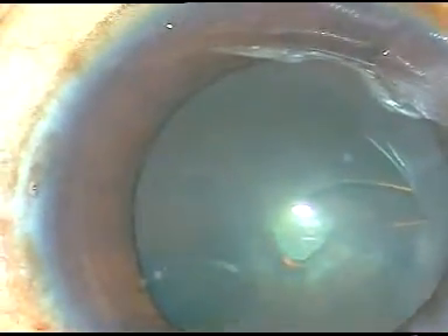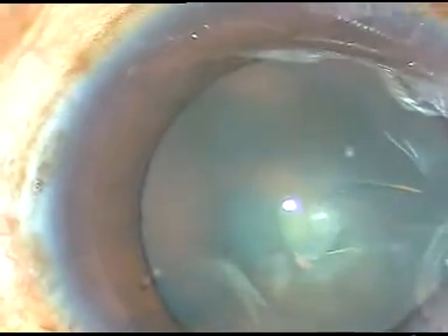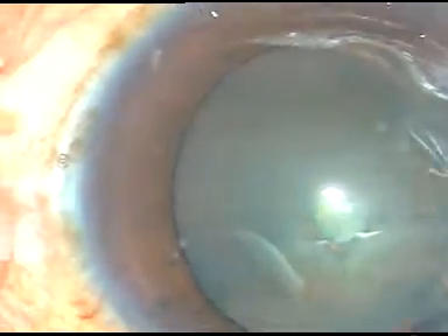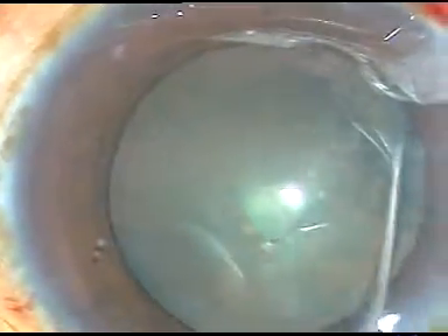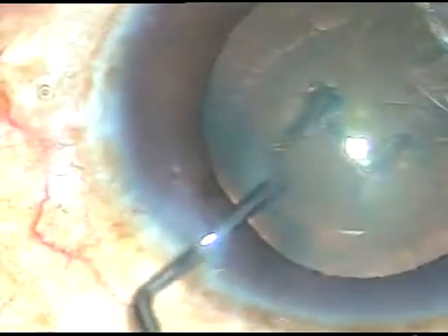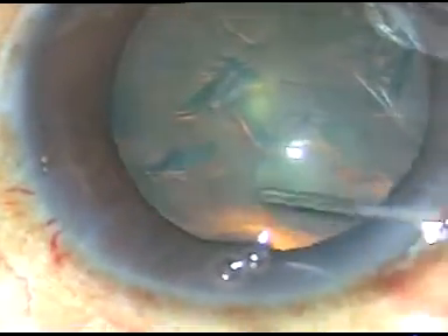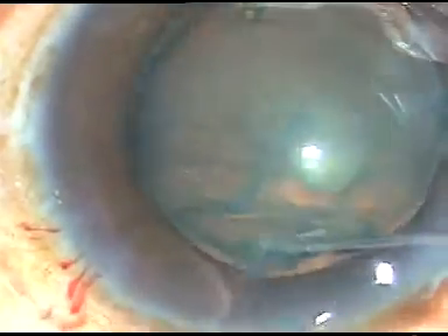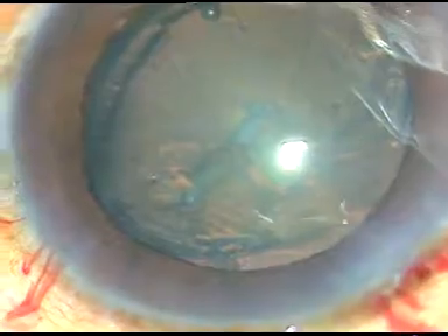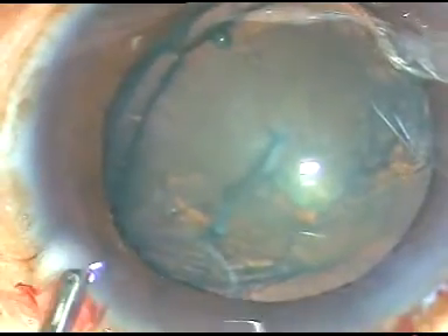Hydrodissection is done with balanced salt solution. This is a 27-gauge cannula. The BSS is passed from one equator and it goes to the other equator. This is one more hydro to prolapse one equator of the cataractous lens out of the capsular bag.